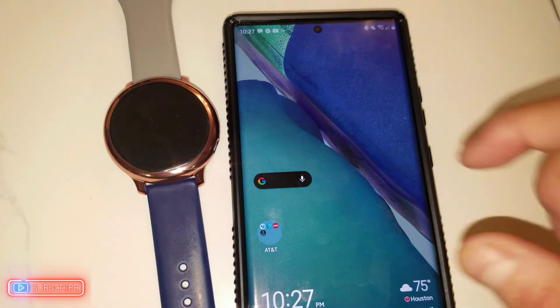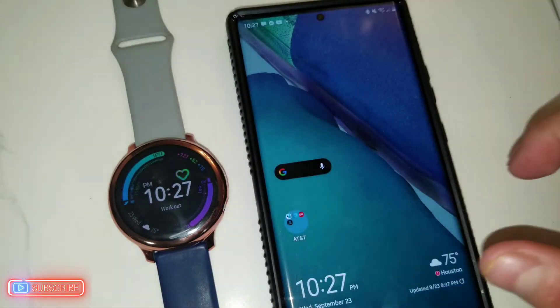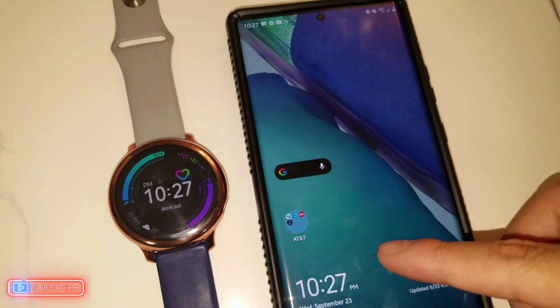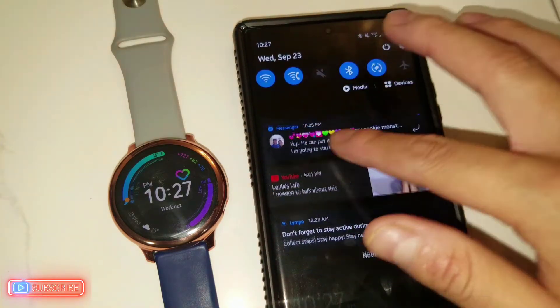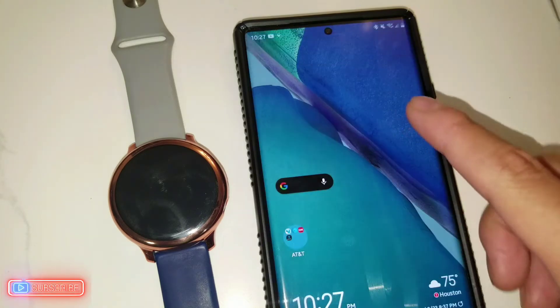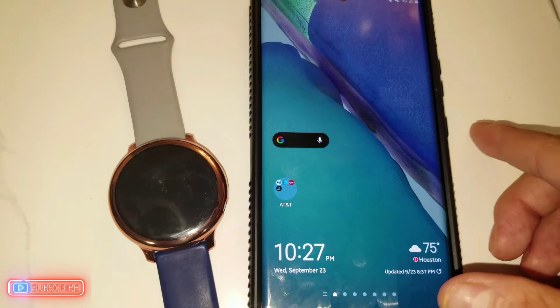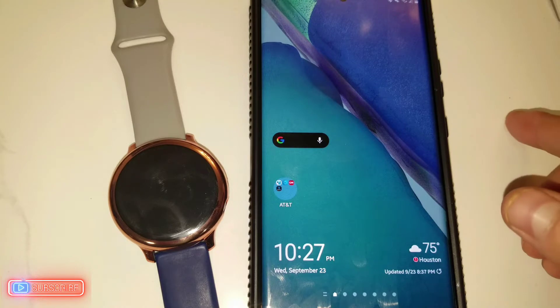You don't have to download any modified application to use the ECG. The only bad news is that unfortunately it will only measure the ECG with a Samsung phone — non-Samsung phones are not going to be able to do that. Only Samsung phones will be able to register the ECG on your watch.